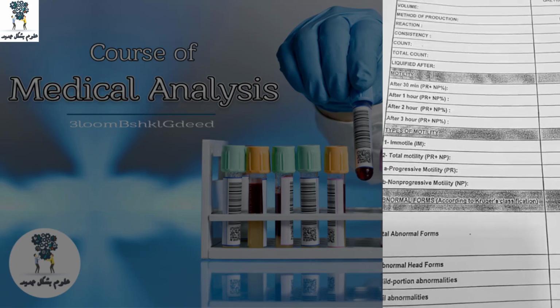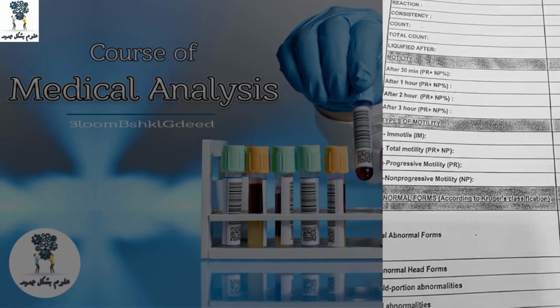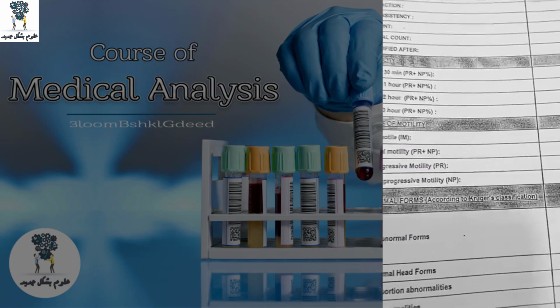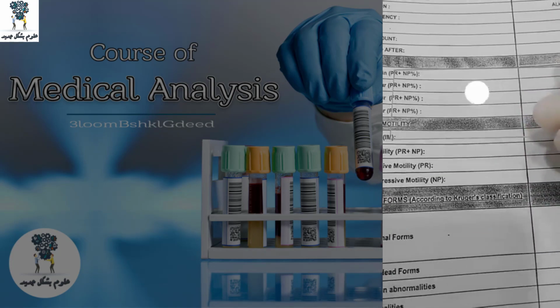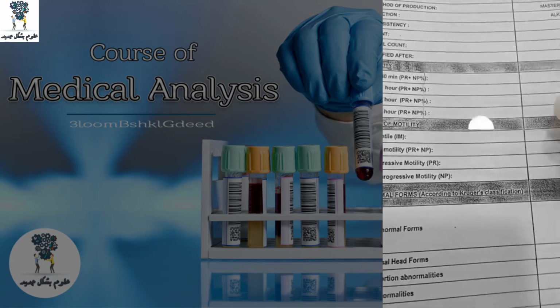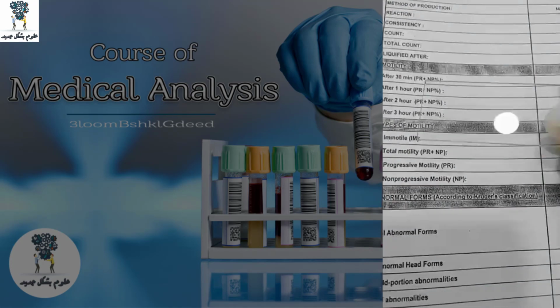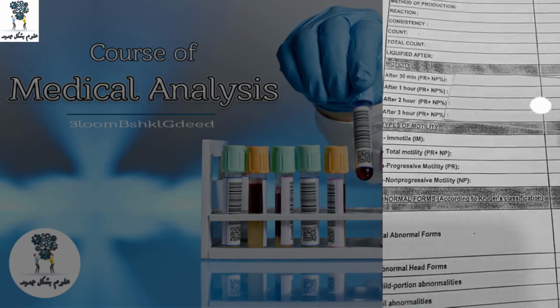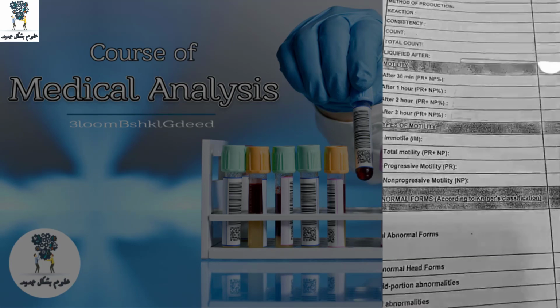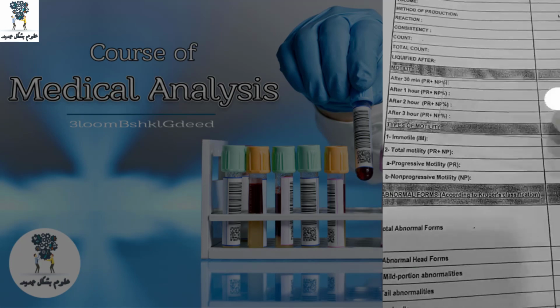اوكي. بالنسبة للبوينت اللي احنا عايزين نتكلم عنها الموتيليتي. يعني إيه الموتيليتي؟ كلمة موتيليتي يعني الحركة. احنا قلنا أول ما بنبص بناخد 10 مايكرو بنحطها على السلايد الشفافة الصغيرة وبنحطها تحت الميكروسكوب. بنشوف حاجة من الاتنين، يا إما سبرمات مش بتتحرك يا إما سبرمات بتتحرك. فاحنا بنقول في الحالة دي إيه الموتيليتي؟ السبرمات اللي بتتحرك بتتحرك حركة سريعة ولا متوسطة؟ لو بتتحرك حركة سريعة بنسميها مصطلح اسمه progressive.